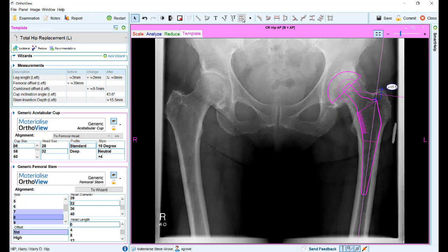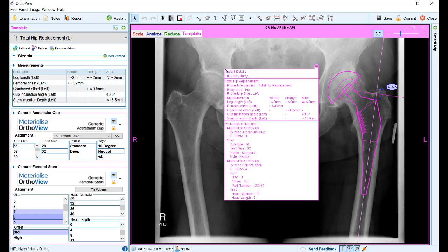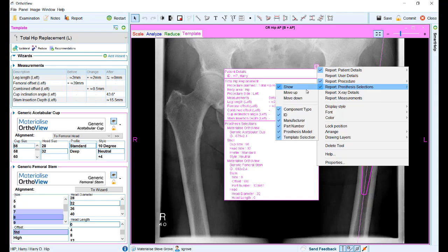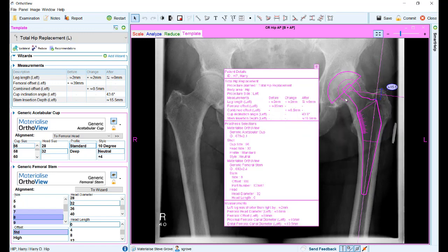There have also been a number of enhancements to the ability to display report information on the x-ray view. This now contains a lot more detail and information than in the previous version. Modifications to the content can be done by left-clicking the box at the top right of the panel, where individual sections can be added, removed, their order adjusted, and individual pieces of information within those sections can also be modified.